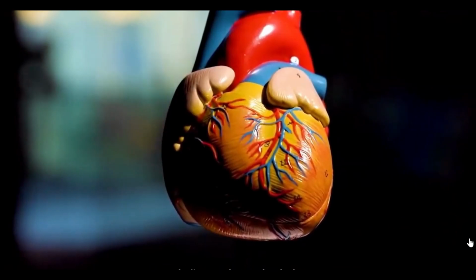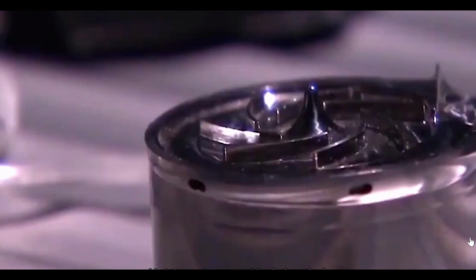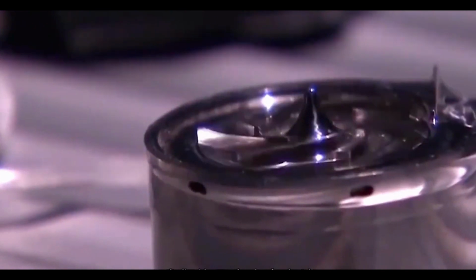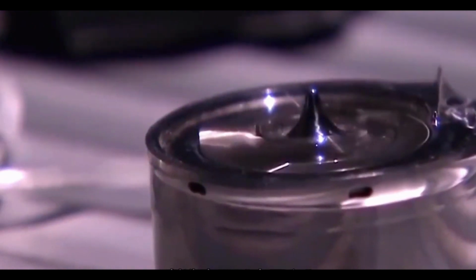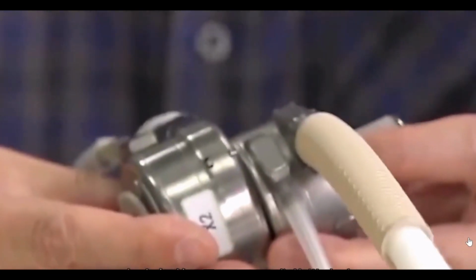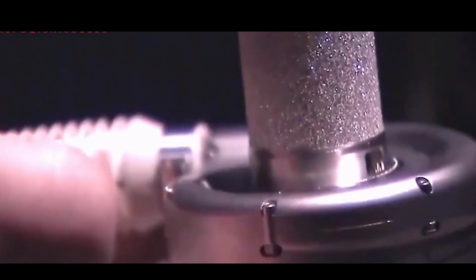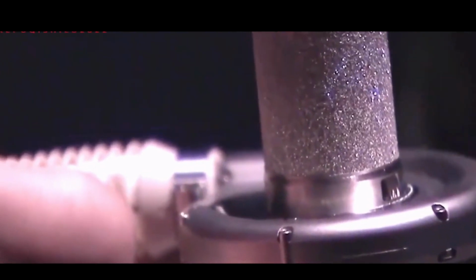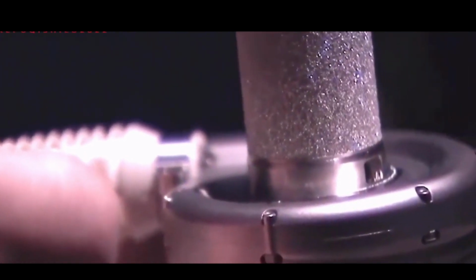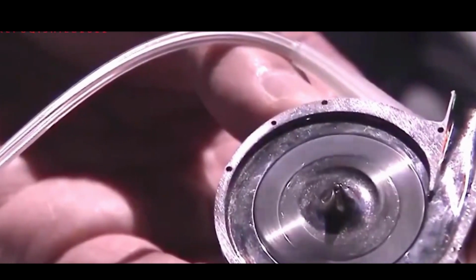The theoretical maximum flow rate that the third-generation artificial heart can provide is 10 liters per minute, far exceeding the 5-6 L per minute heart displacement required for patients' daily activities. This is like replacing a 1.4-liter displacement car with a 3.0T engine, which has very abundant power, far exceeding daily needs. So, after installing an artificial heart, patients can enjoy a high-quality life, engage in daily activities, and even return to work.